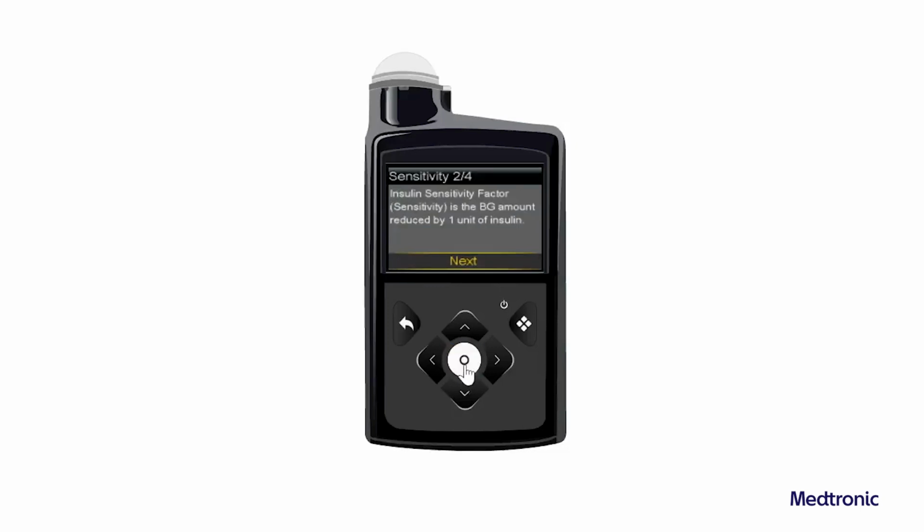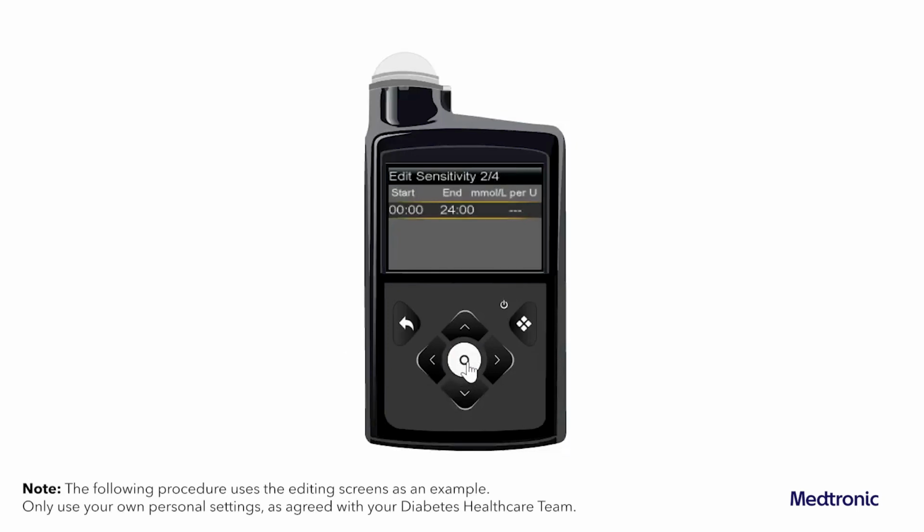The sensitivity 2 of 4 screen appears. Select Next. The Edit Sensitivity 2 of 4 screen appears. For one sensitivity factor, enter the millimole per litre per unit and then press Select. Select Next.